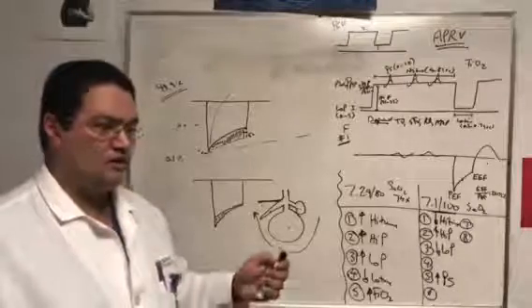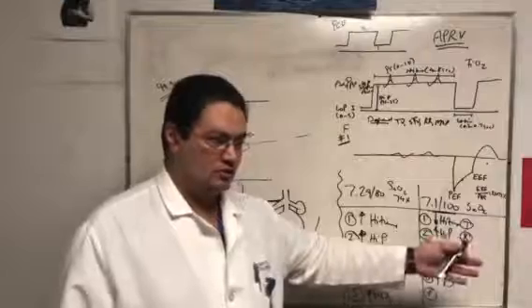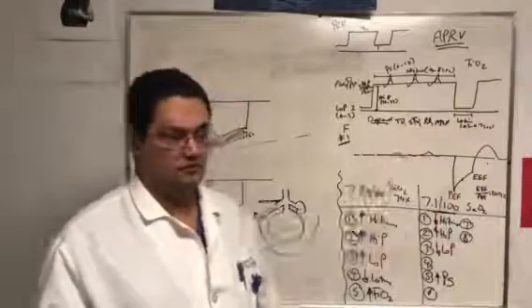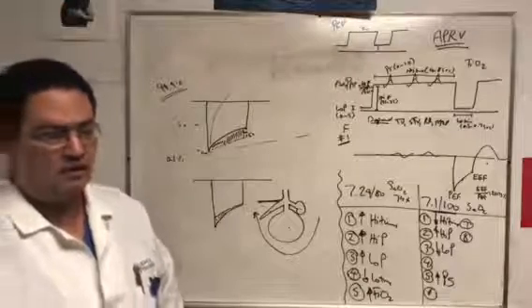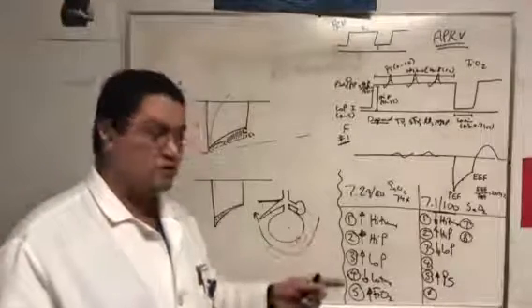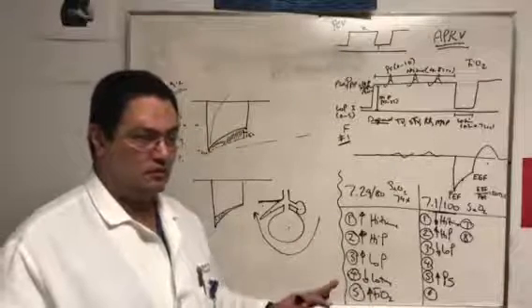So that's why there's a fear that if we add pressure support to the mode of ventilation, we might negate that benefit, because we're giving a positive pressure to a negative pressure breath, right? So we might negate this. That's why people are moving away. That's why pressure support is always 0 in this and in bi-level, always 0, the pressure support.